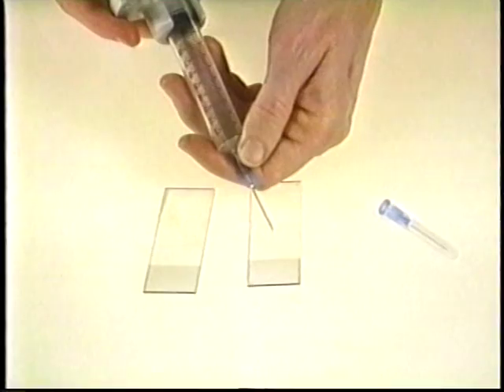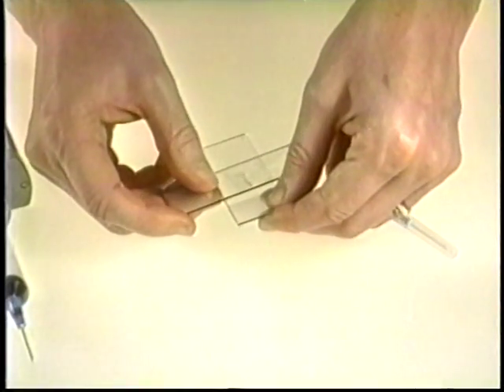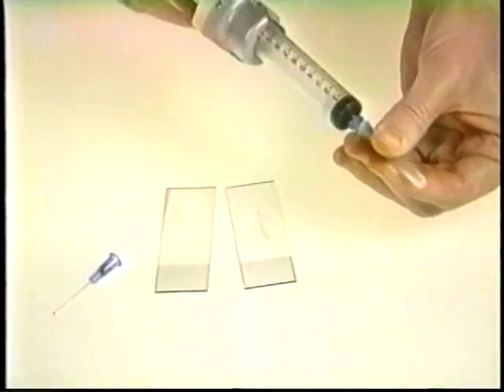Therefore, the person who is going to prepare the material should be standing right next to the operator during the procedure. Reach for the sample and have the workstation ready with all the equipment within a few steps. A new needle should be used for each additional sample in order to facilitate expulsion of the harvest and to avoid introducing already clotting blood into the subsequent samples.